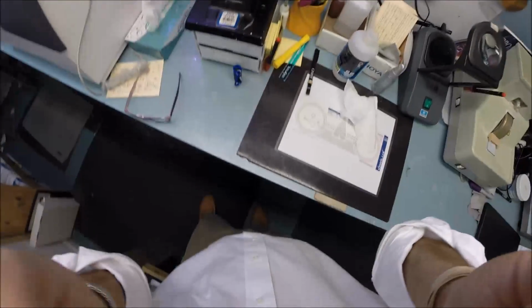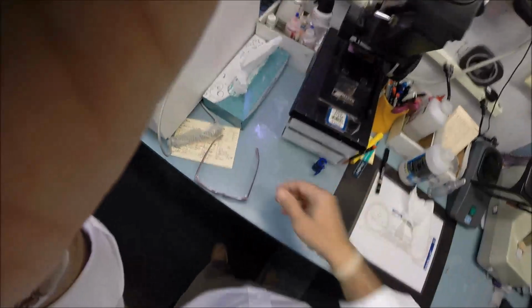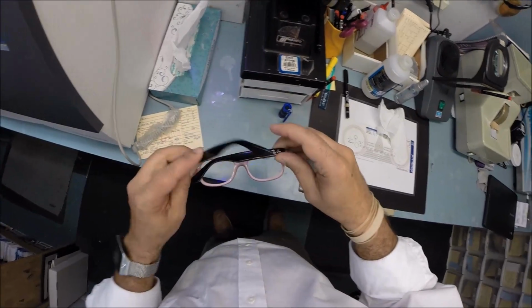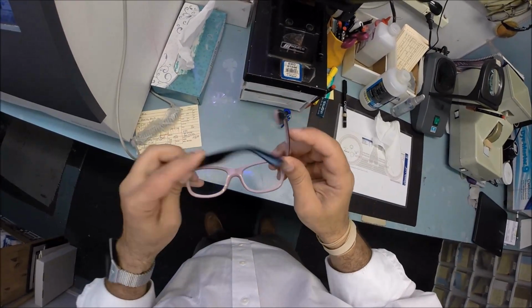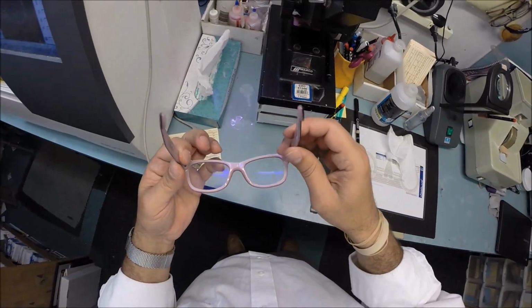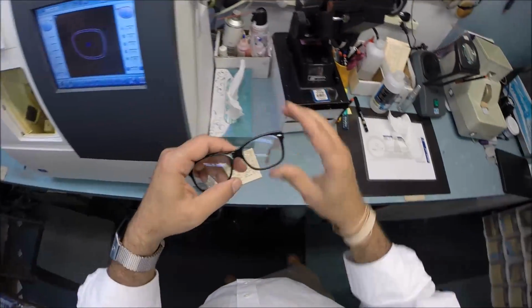So, put mine back on so I can see what I'm doing. I've got to raise the camera up just to put mine back on. So, flip these over, press down. There is no wobble. Close each temple to make sure they overlap perfectly, and they do. Look, RayBan. What's the chance of that being on both sides? So, that is good. Now, this is what your lenses look like clear.